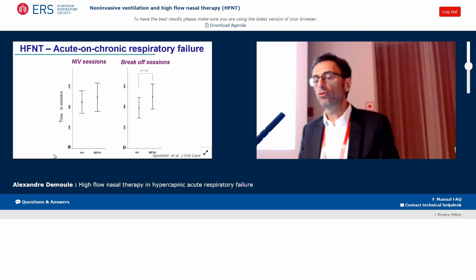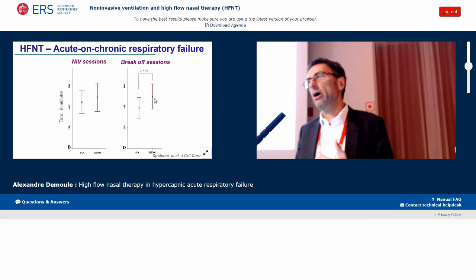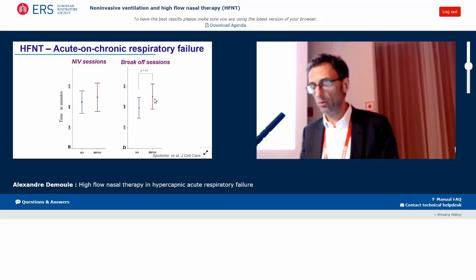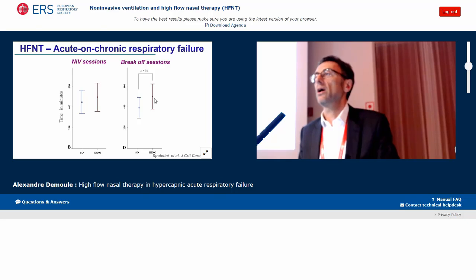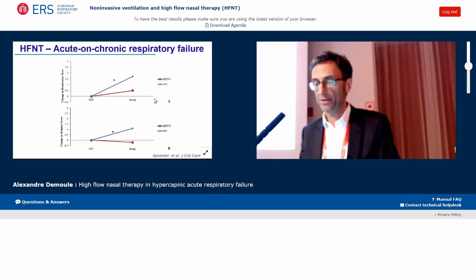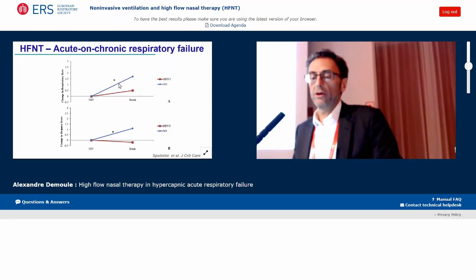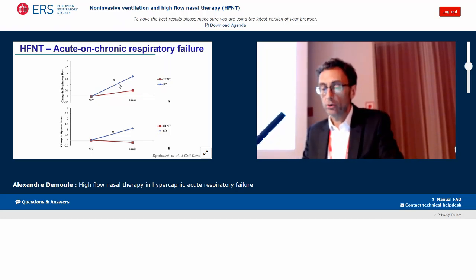And we can see that the duration of non-invasive ventilation sessions was the same in the two groups, but the duration of the breaks between sessions, so the period where patients could tolerate not receiving non-invasive ventilation, was a little higher in patients receiving high flow nasal therapy. Second point, changes in the respiratory rate and dyspnea score. Here we have the change in respiratory rate between the non-invasive ventilation session and the break.